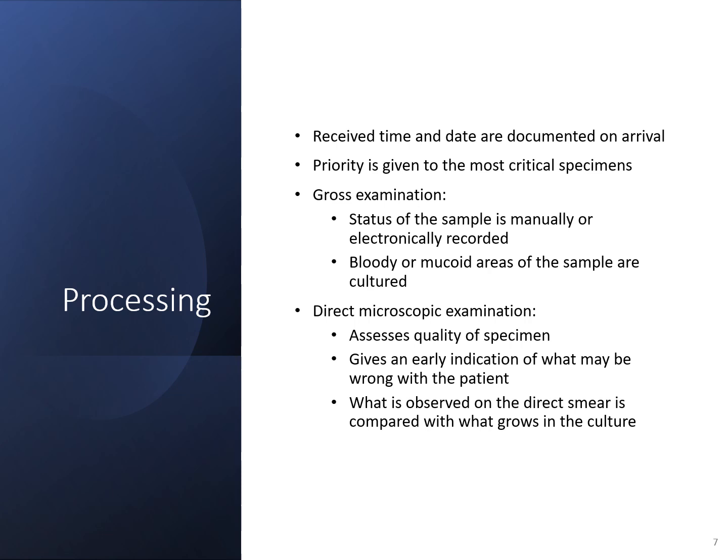With a direct microscopic examination, you're preparing a slide directly from the specimen source. So for example, a sputum culture would come in a cup with the sputum actually in the cup. You would make a slide off of that sputum sample, rolling it onto a glass slide. So rather than taking it from the culture and looking at the organism, you're looking directly at what comes from the patient.